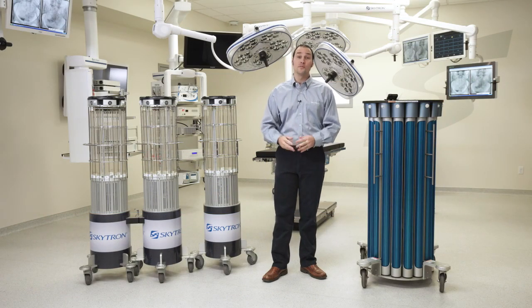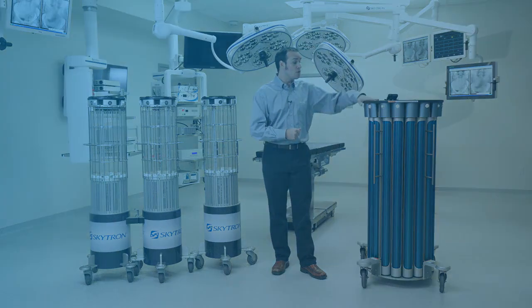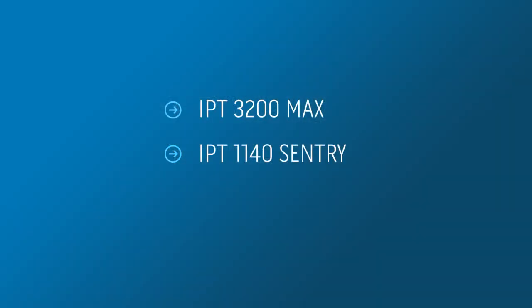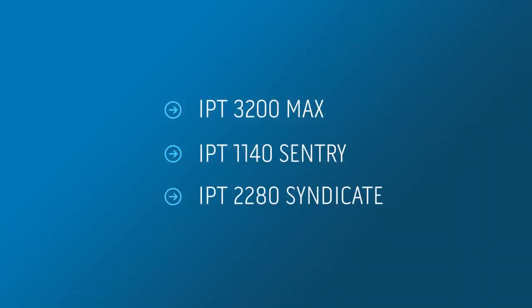Hello, I'm Mike Piontek. Welcome to the Skytron UVC robot training video. In this video we will cover our 3200 flagship robot, the most powerful UVC device on the market, also our single emitter 1140 system and our dual emitter 2280 Syndicate system.